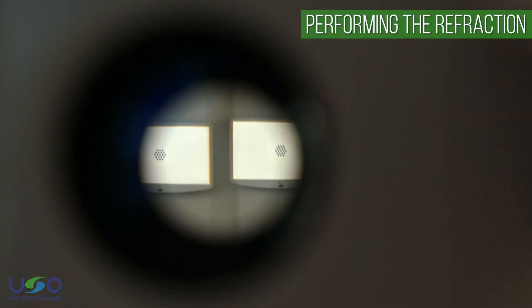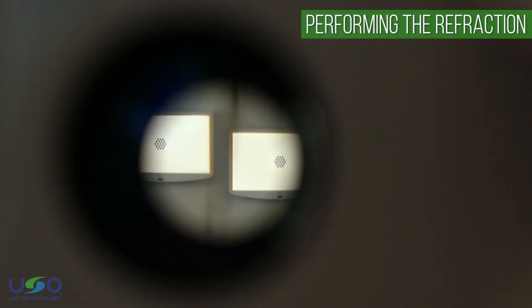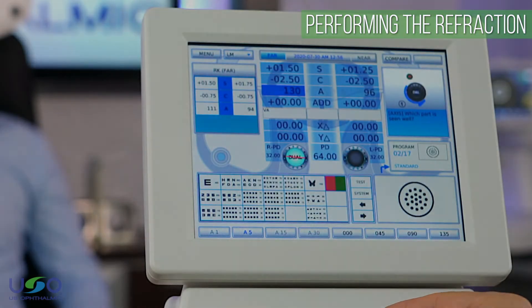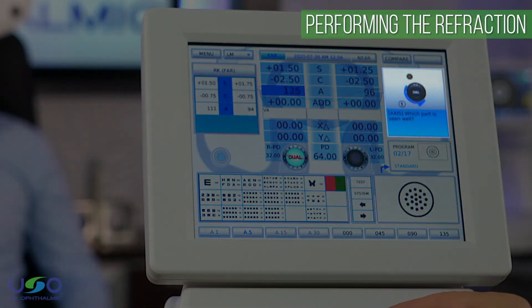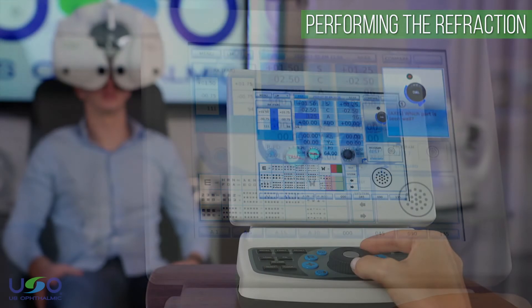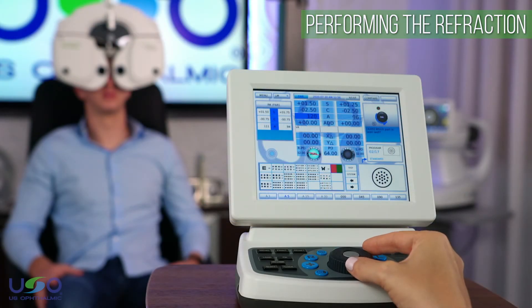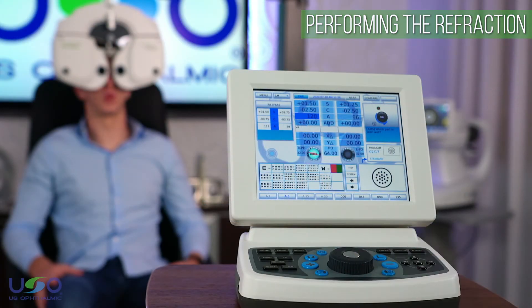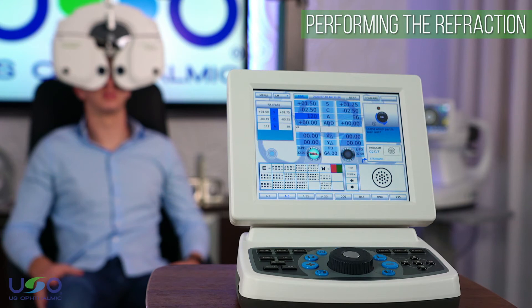As the patient provides feedback on which cylinder presents a clearer image, the guide indicates in which direction to rotate the cylinder axis to make the necessary adjustment. This step is repeated until a balance is achieved between the images that the patient observes with both cylinders.